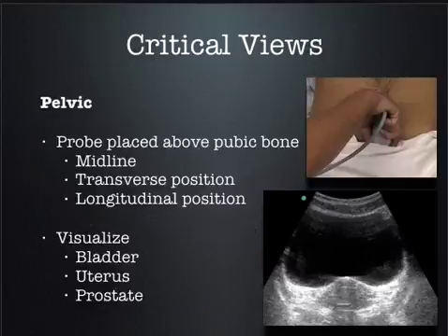And then the last view is the pelvic view. You want to look for the bladder. You want to look side to side around the walls, and then you want to turn 90 degrees. This is the only view in the fast exam where we do it in 2 views. So we do a cross section and a long axis. And we look for free fluid outside the bladder.